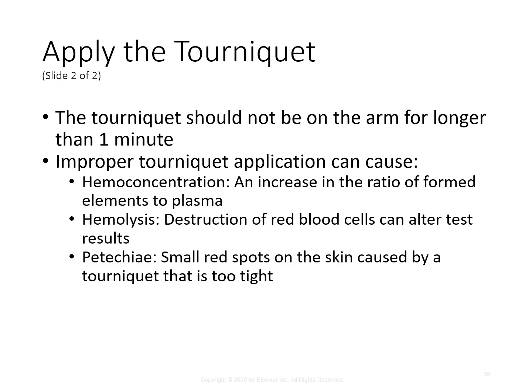The arm should not turn red and the fingers should not tingle, and you should continue to be able to feel a radial pulse. If the arm starts turning red and the fingers are tingly, it's on too long and probably too tight as well.